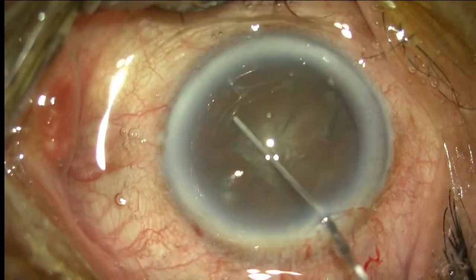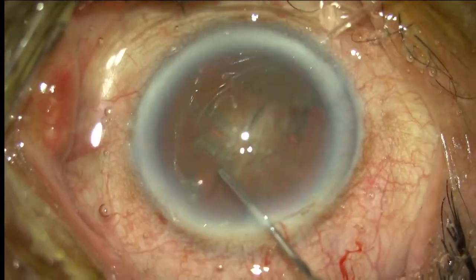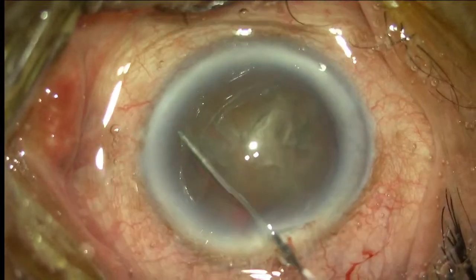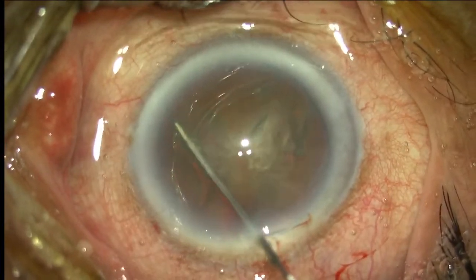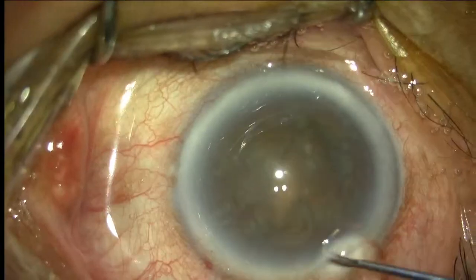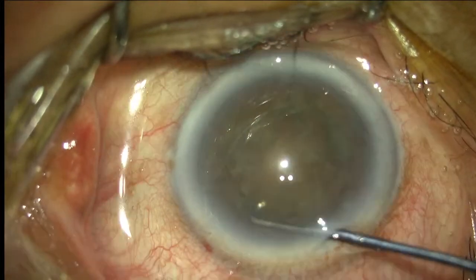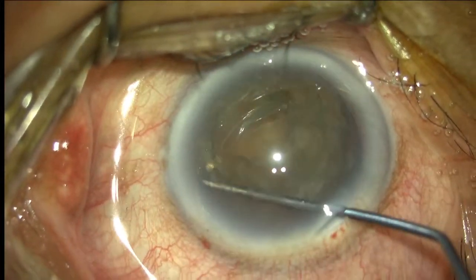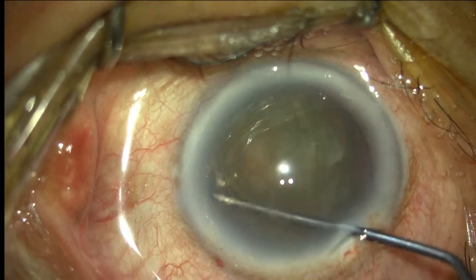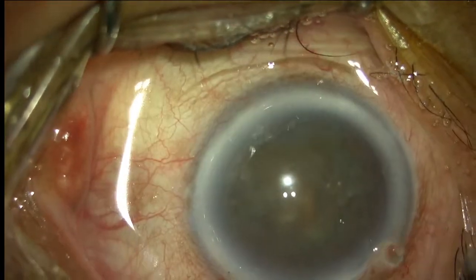So this is what I did, a complete hydrodissection, and active also after I rotate the nucleus. So you can see that well. This is very important because you start any kind of a chopping technique.